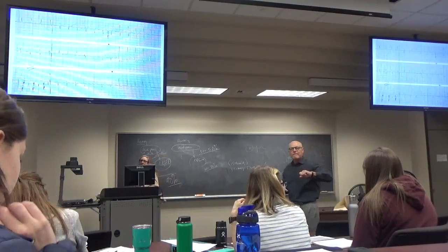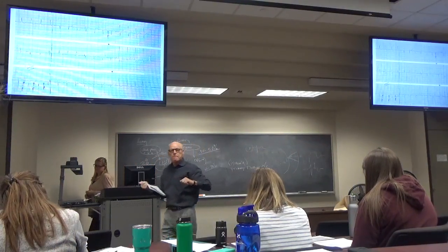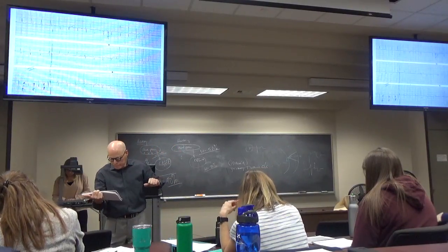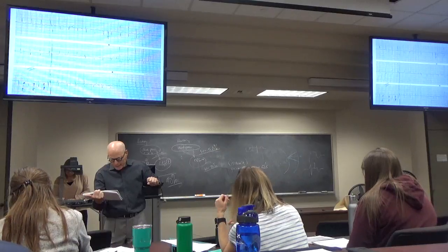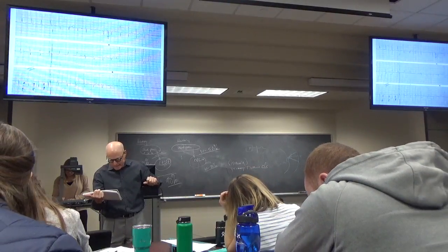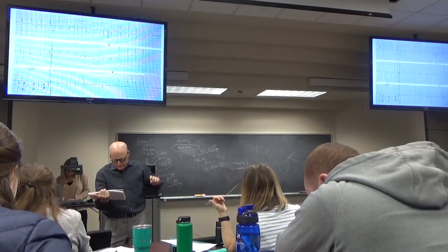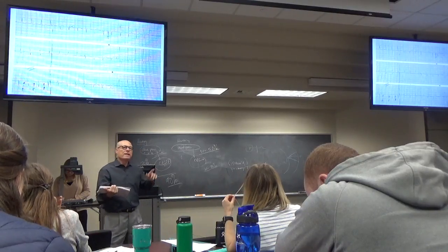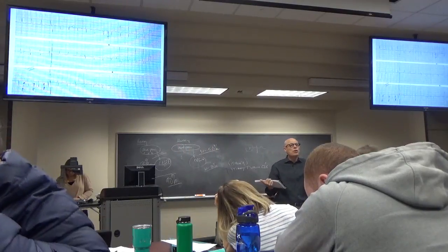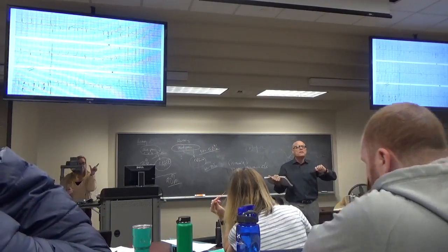I just have a question. I thought I maybe saw delta waves in lead 1, 2, AVL, and AVF. I don't know if that is true or not, but I was just looking into delta waves off of Jacob's lecture. Yeah, there aren't any delta waves there, but it's a good point. When would you look hard for delta waves?